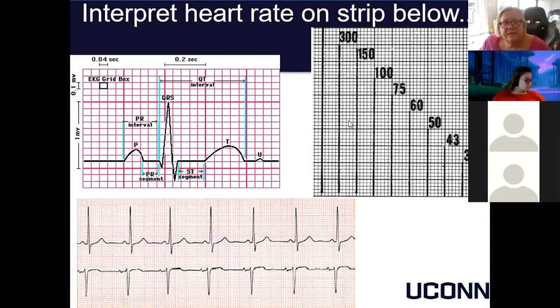So again, this is looking at where you start the measurement. Does that make sense, Jack? Yeah, I know it's super important to understand it all. I was just wondering because I was questioning the ones I've seen. Yeah, you're right. It's there in a 12 lead. It's not there if you're doing a rhythm strip.